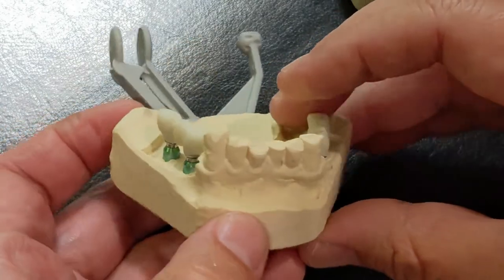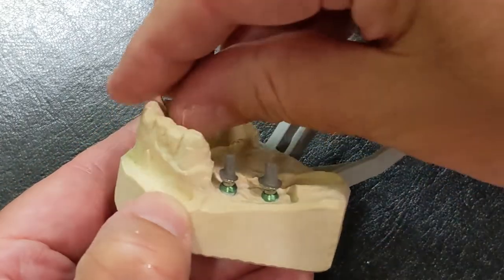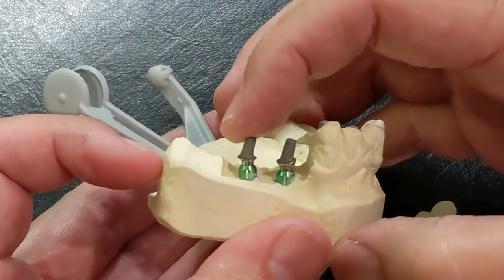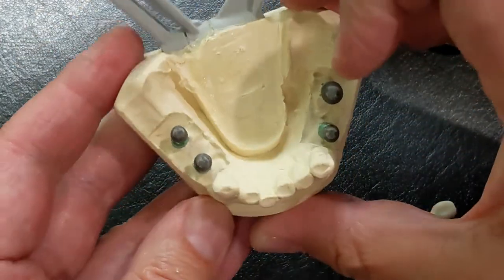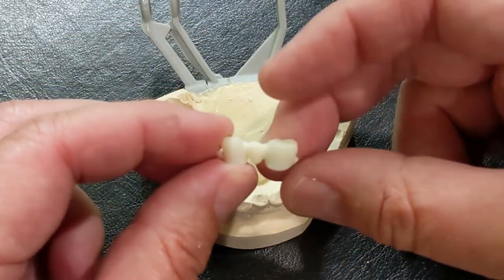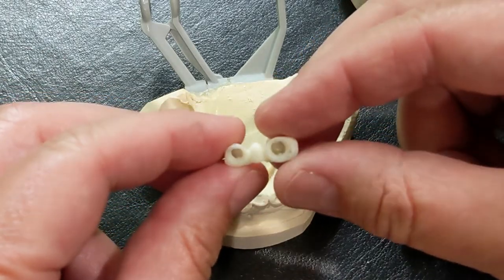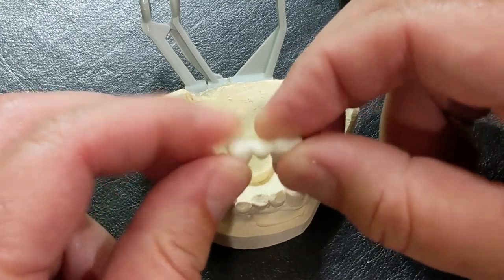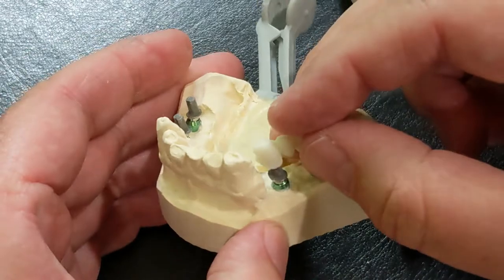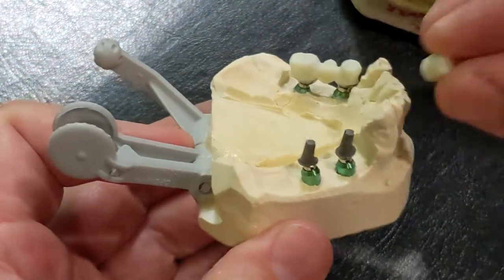We placed four implants and had the lab make these four custom implant posts to fit the Bicon implants — you can see these two here and these two right here. They also sent me back the Trinia framework. This is the material that the framework that the bridge is actually going to be made out of. Trinia is almost like a fiberglass type of material — very tough, very strong, with a little bit of give to it — but it can be used for a three-tooth bridge, or actually even a full arch bridge if you wanted to.